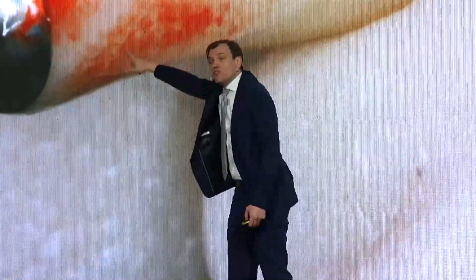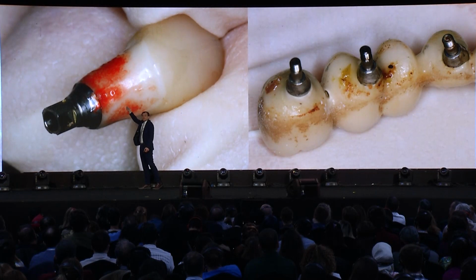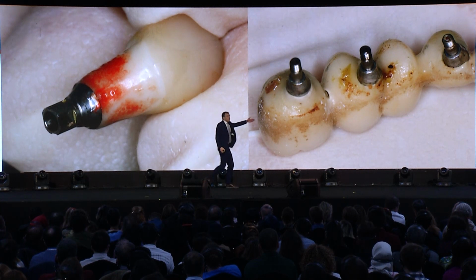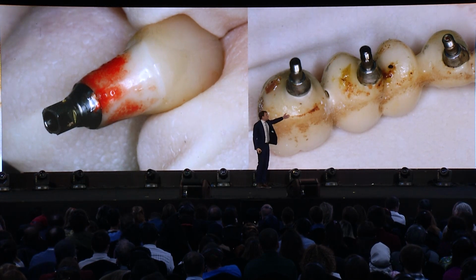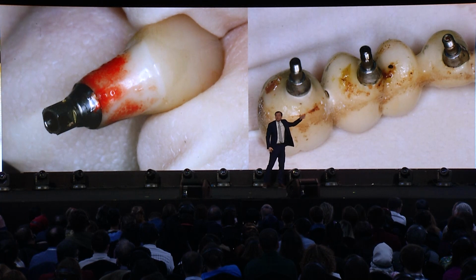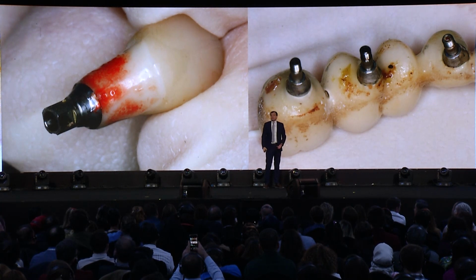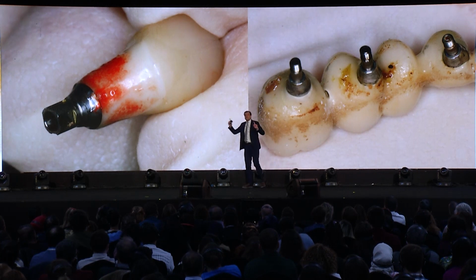When I removed the restoration from the implant, this was the integration of the tissues to the zirconia, and you can see that part of the tissue still remained, remnants of the tissues on the restoration. While in the other material, this is glaze material, you can find remnants of the breakfast, not remnants of the tissue. So look how it's different.